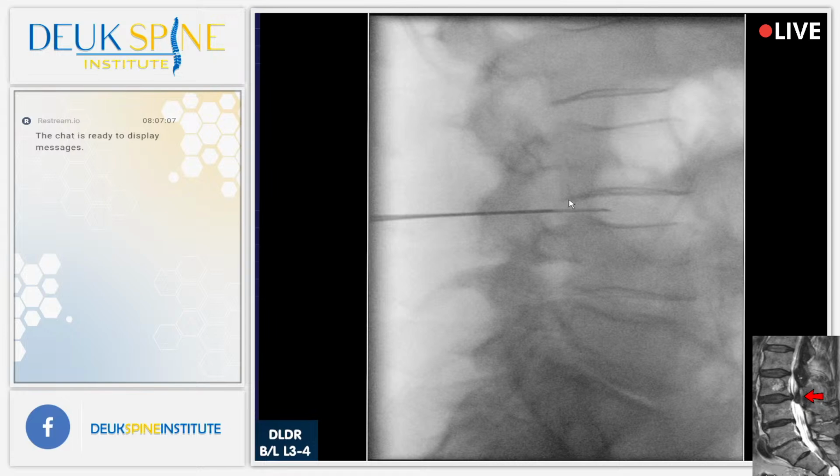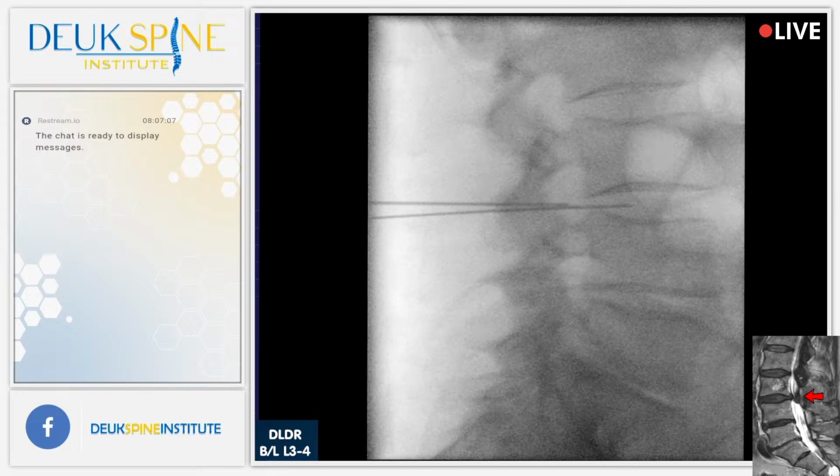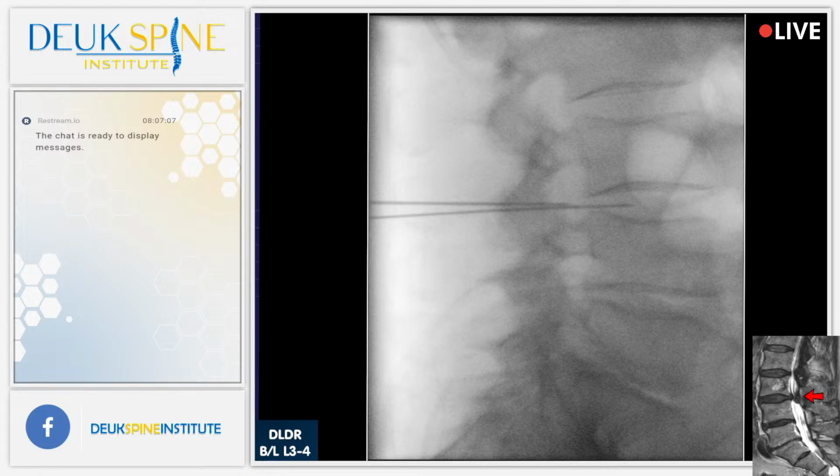That means that our fluoro is not perfectly lateral to the vertebral body because he's moved around a little bit, wiggling around. That's about 1 degree off. So you want to shoot through the back of the bone perfect. You want to look at the back of that bone and it should be lined up perfect. So Jordan will probably, there it is. That's perfect now. Okay? It's important, folks, you get the x-ray picture perfect before you place the needles. Otherwise, you'll be placing the needle somewhere you think you're going, but you're not in the right place.